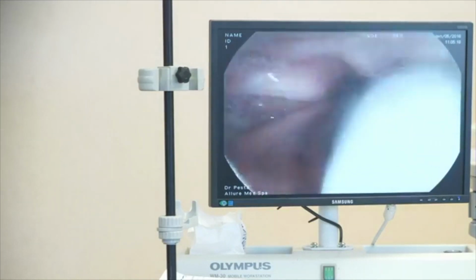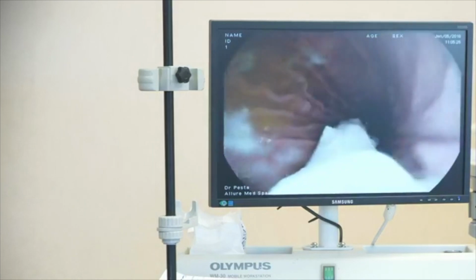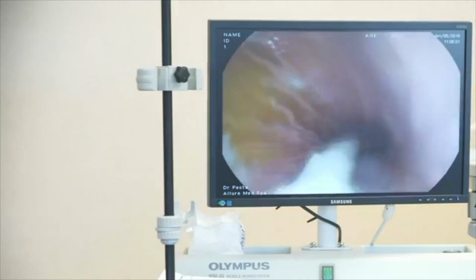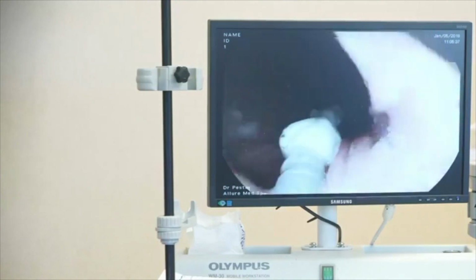Hiccuping is very common during the procedure, nothing to worry about. So as I mentioned, it's a sedation procedure, not a completely asleep procedure. So making noises and movement is quite normal during this portion of the procedure. So now we see the balloon is comfortably in place in the body of the stomach, and we're going to start to inflate it now.